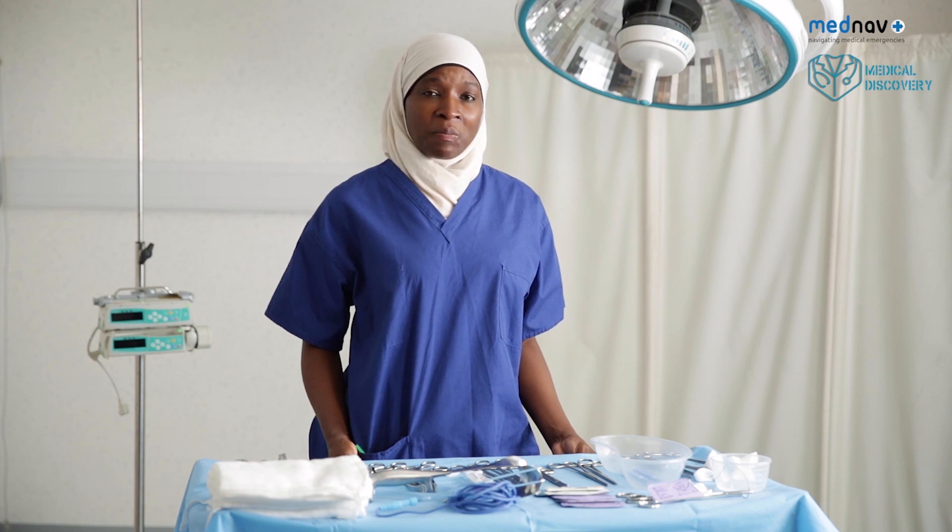This will cause relaxation of the uterus and allow you to deliver the head. However, this may cause postpartum haemorrhage.